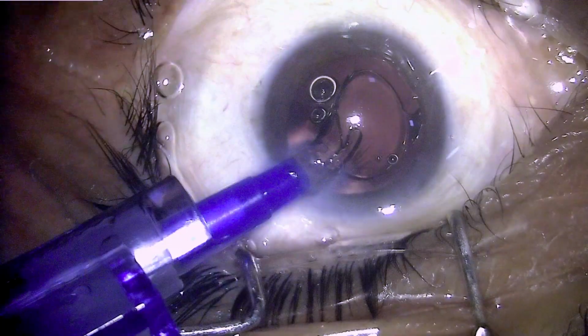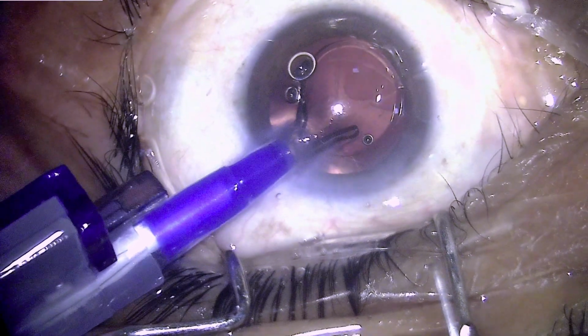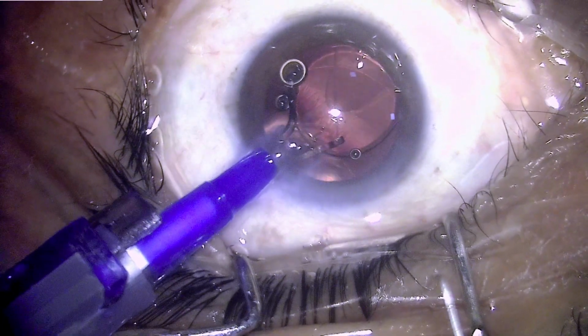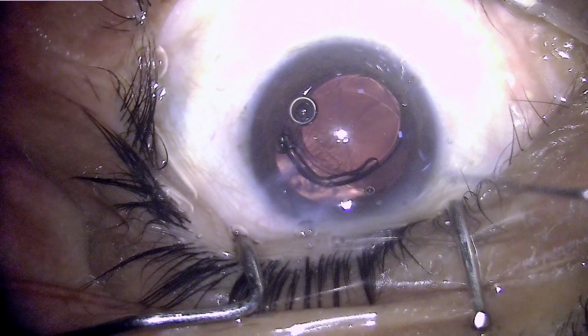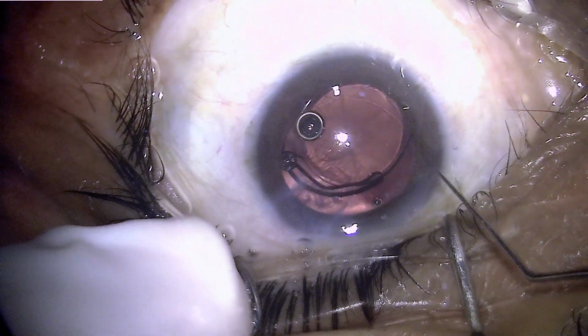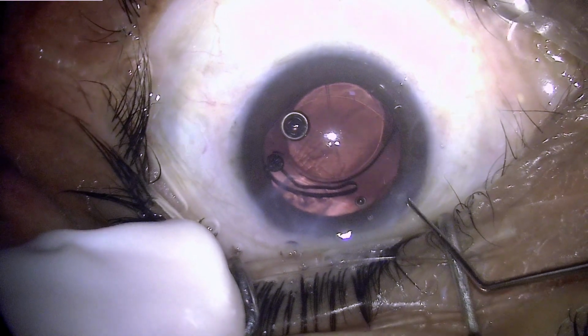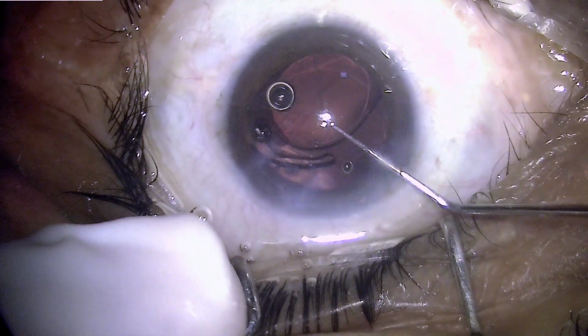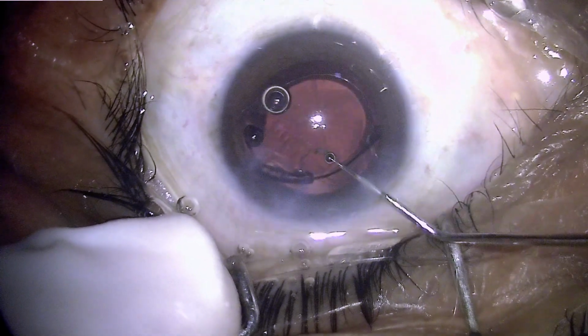Now there is one more complication which I can see is happening, and that is the leading haptic has got twisted because of improper orientation in the cartridge, and I can see that it is causing the IOL to twist to one side. Now this is one added complication which I was not anticipating. However, we will see what can be done.